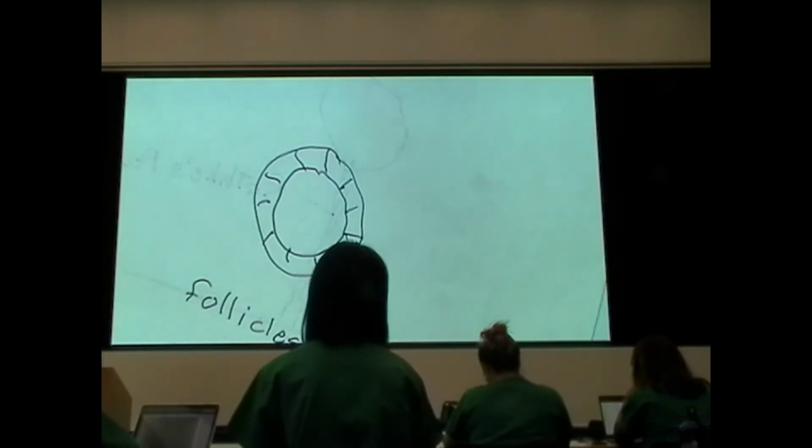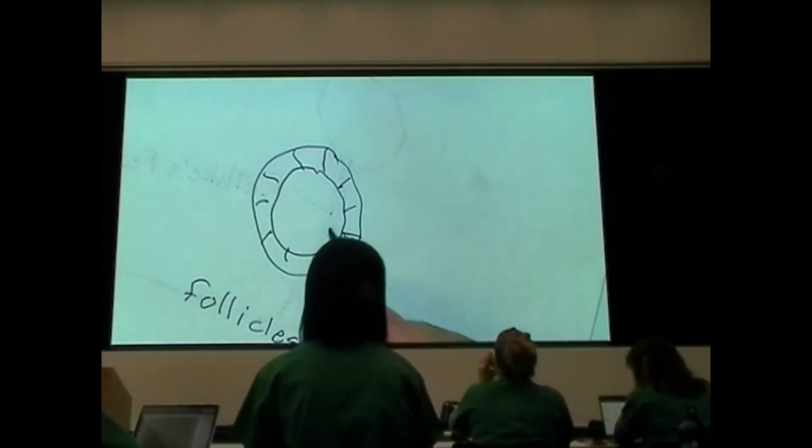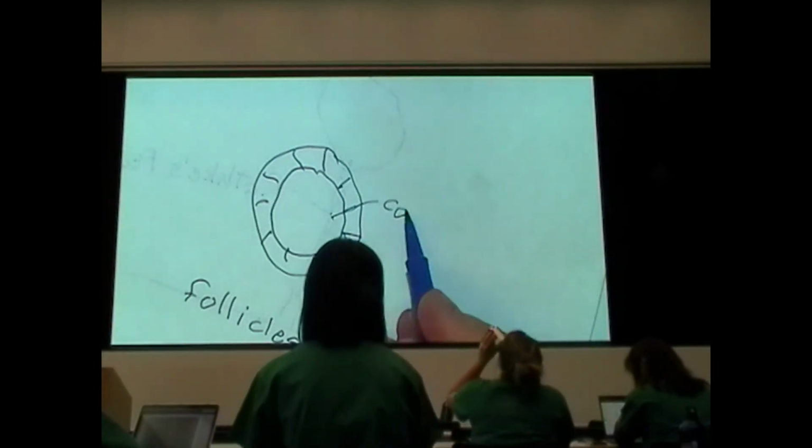And they all contain an eosinophilic material, which is referred to simply as colloid.